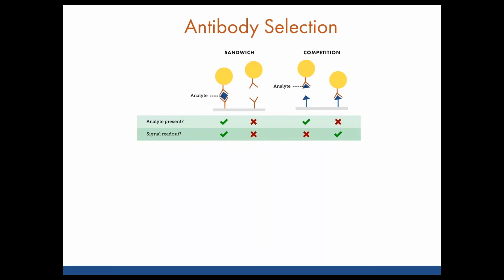Because the assay depends on the antibody, and every antibody has unique properties, they will require different conditions to be the most efficient. There are multiple types of lateral flow formats, and two of the main formats are shown here. For both formats, the schematic is showing what would happen at the test line with a positive or negative sample.